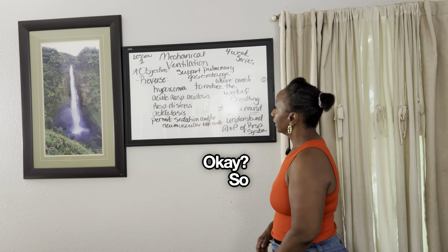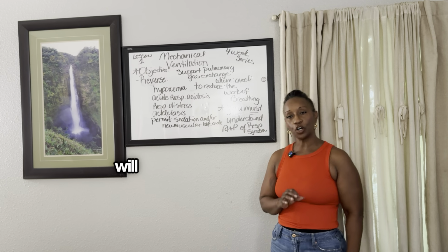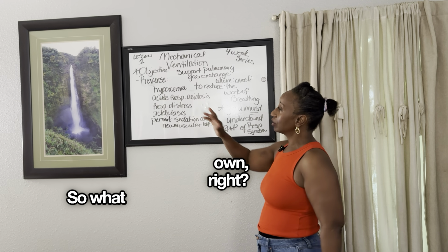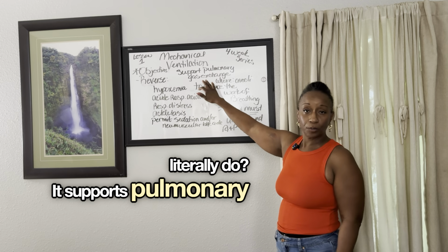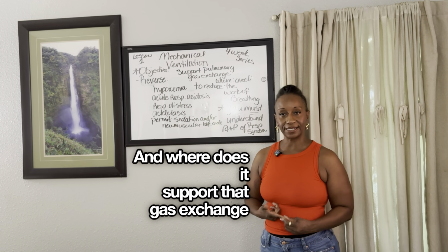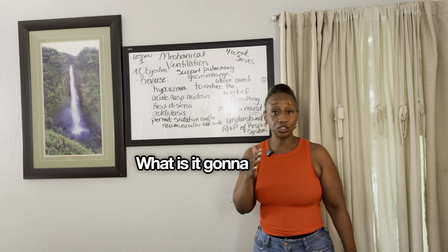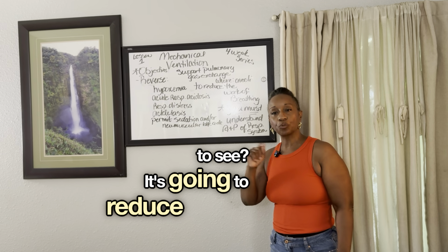Okay? So mechanical ventilation is a machine that will help my patient breathe when they can no longer breathe on their own, right? So what does mechanical ventilation literally do? It supports pulmonary gas exchange, right? And where does it support that gas exchange at? It supports it in the alveoli. Yes? What is it going to do for my patient at the bedside that you need to see? It is going to reduce the work of breathing.